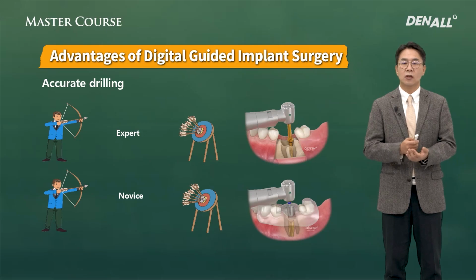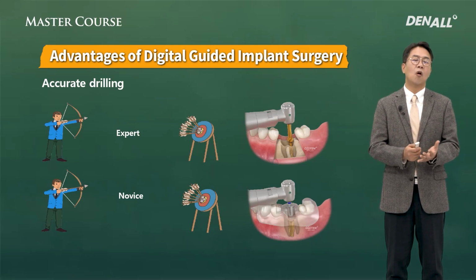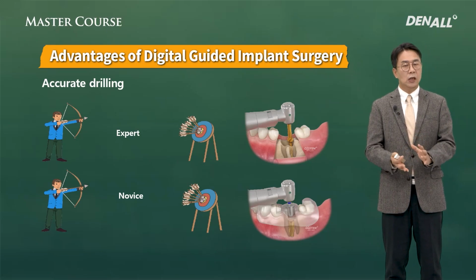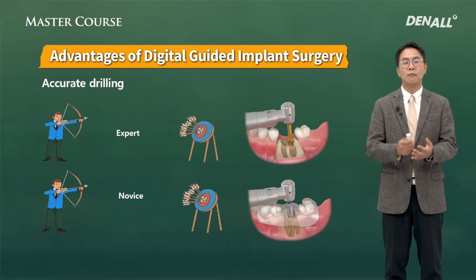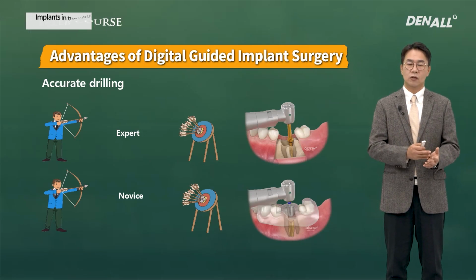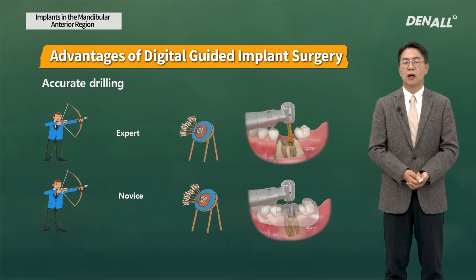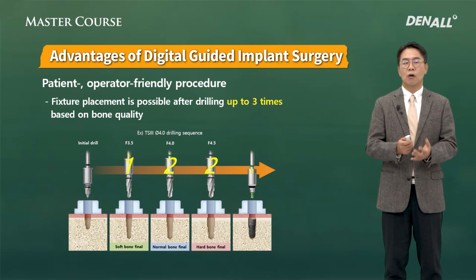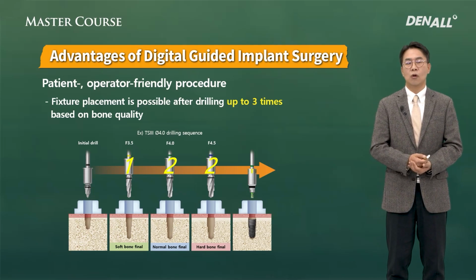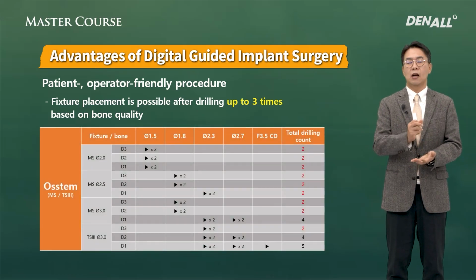A guide template can make you place implants very accurately in the position that you want, regardless of the clinical experience. Of course, you need to gain experience in the guided surgery, but implant positions and the depth can be controlled regardless of the surgeon's experience. And number of drilling can be reduced. So for patients, the surgery can be finished simply and saves time for surgeon as well.